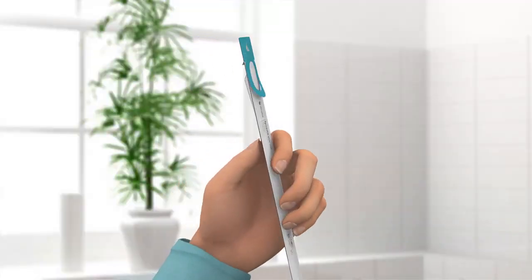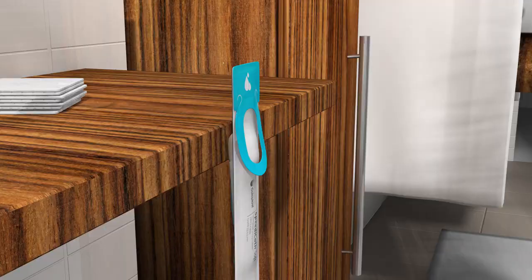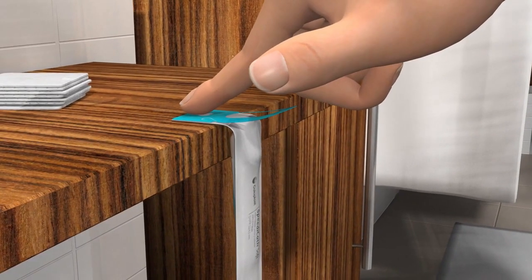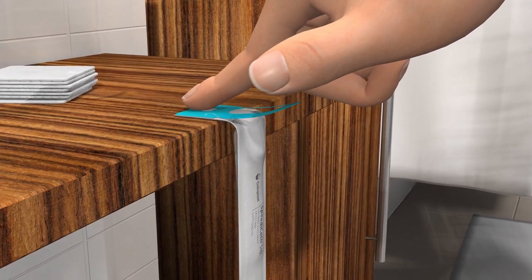Start by removing the label that covers the sticky spot on the package. Press the spot onto a clean surface. Make sure the package is hanging straight down and that it is easy to reach when you are ready.